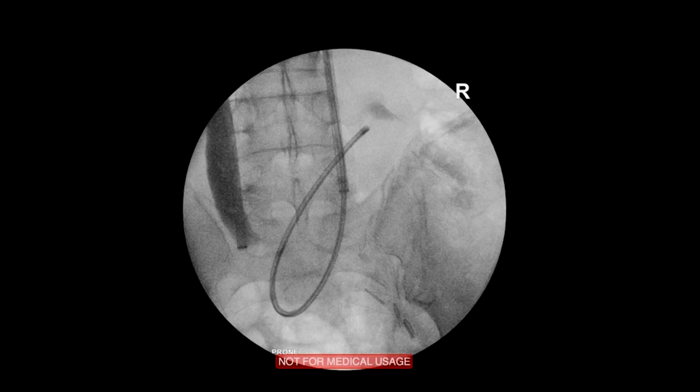So for me, with our current 100-watt laser, this is going to be at a setting of maybe 30 hertz, 0.4 joules. I can't actually change the pulse width on this particular laser, but this very effectively fragments the stone into tiny fragments. And then you can see on this final image from this case that we've actually got access through to the conduit, with our ureteroscope on the right-hand side. So we know that there's a way through there.